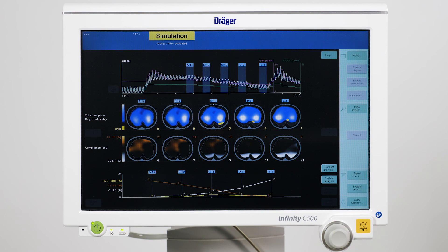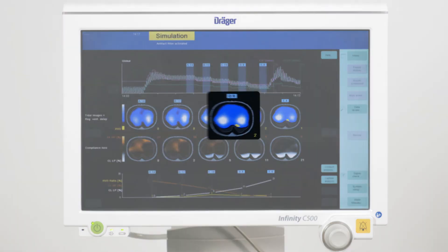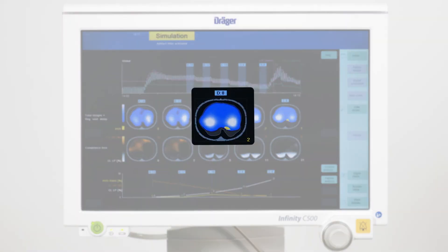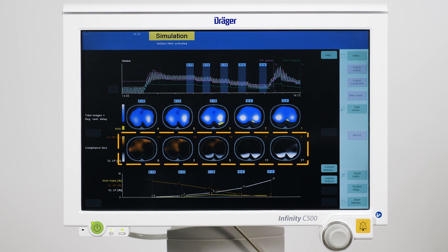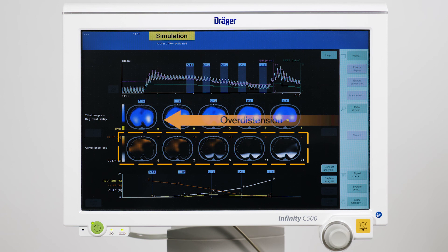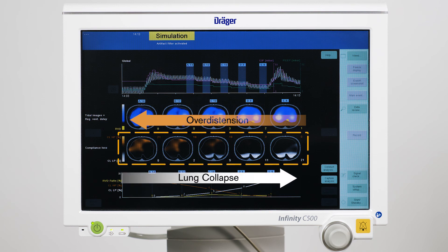In this clinical example, five PEEP steps have been identified and for each step the corresponding tidal image is displayed. This series already displays nicely at which PEEP level major lung collapse starts. The second row displays maps of regional lung compliance. The loss of regional compliance towards higher PEEP levels, which indicates overdistension, is displayed in orange color. In contrast, the loss of compliance towards lower PEEP levels, typically caused by lung collapse, is displayed in white color.